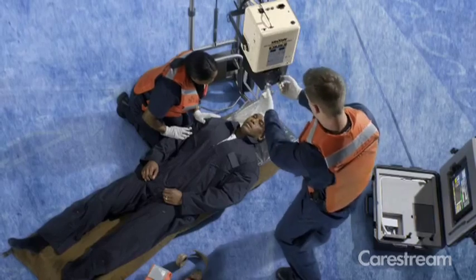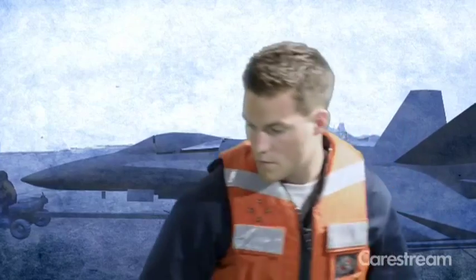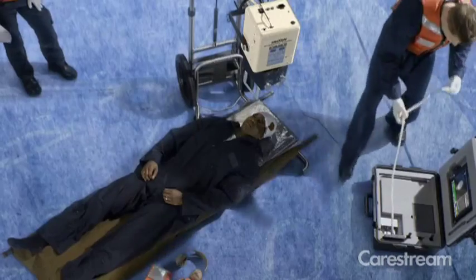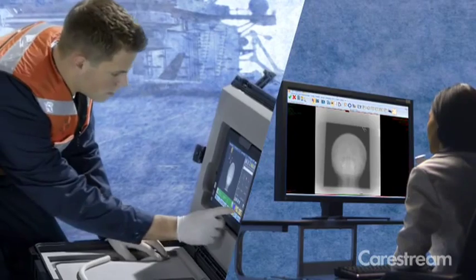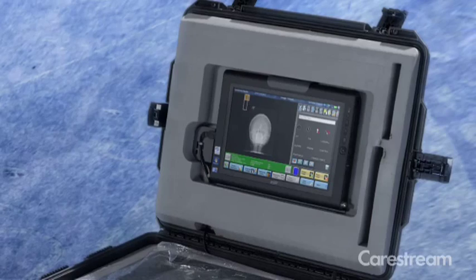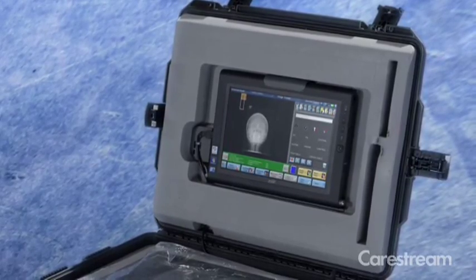Time is of the essence and the wireless transmission capability of our DRX detector allows you to transfer the images instantly via a wide area network connection for radiologist viewing, diagnosis and treatment planning. The battery-powered DRX transportable field portable does not require additional power sources, eliminating a key concern in remote or extreme locations.